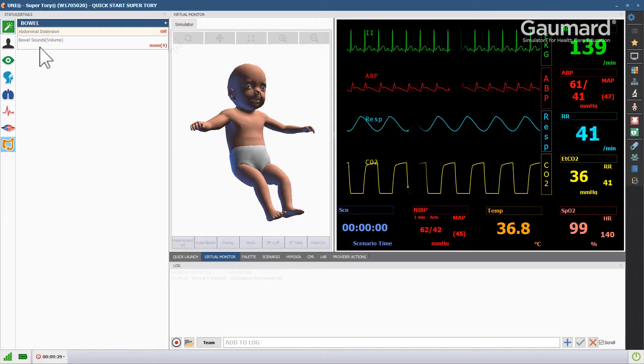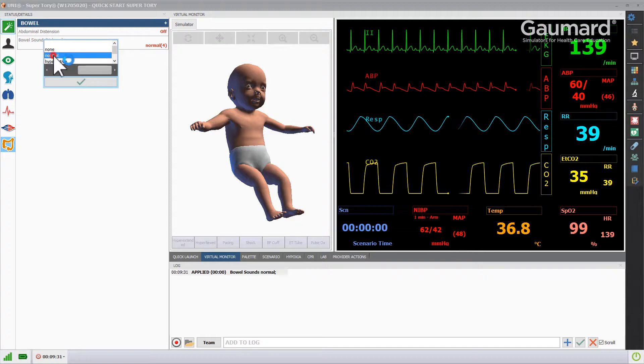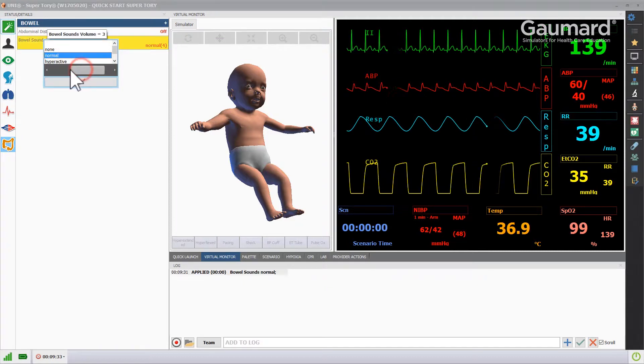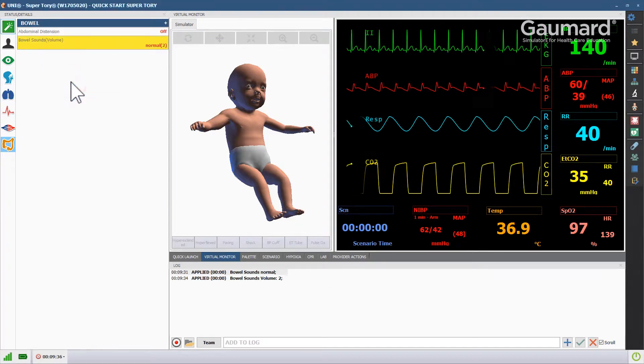To change the bowel sounds, click the bowel sounds vital and choose the appropriate sound from the library. You can adjust the volume by moving the slider to the left or to the right.